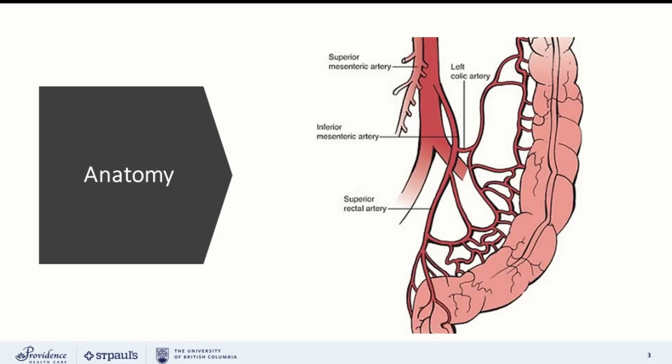So medial to lateral is not new. It is a technique that was actually in some ways proposed by Turnbull, who is one of the founding figures in the Cleveland Clinic, who talked about the no-touch technique, and it's one of the most cited papers in colorectal surgery. But the laparoscopic approach allows us to do this medial to lateral approach with enhanced visualization in a way that is hard to do open, and also employs the CO2 insufflation to really delineate where those planes are.